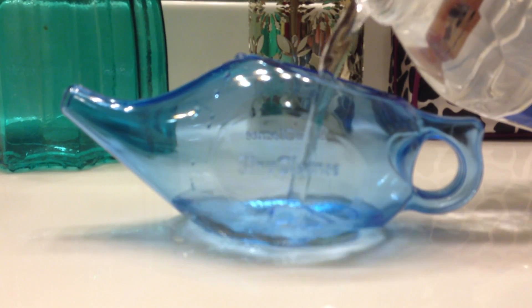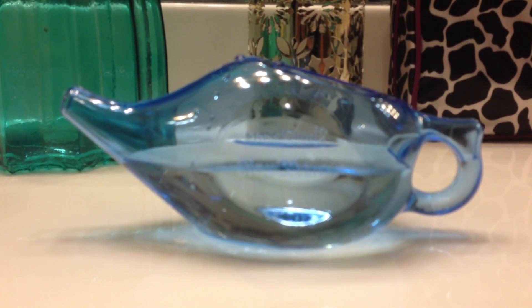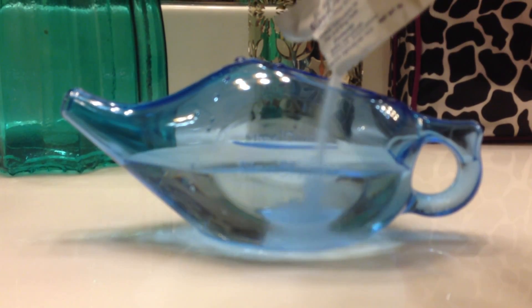Here we are, about to unclog this nose. Put water in the neti pot. Next, put one packet of saline in the neti pot. Oh, they give you one of the — how many packets? 30 packets. That's great.